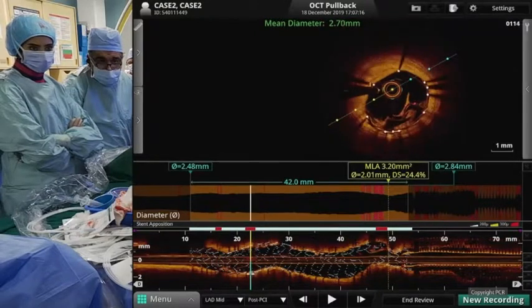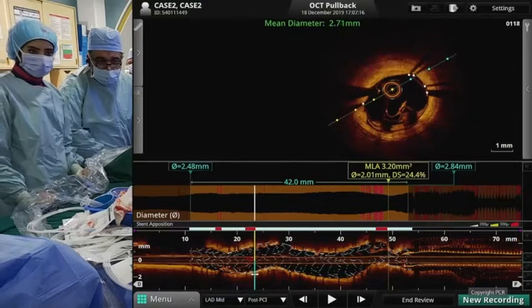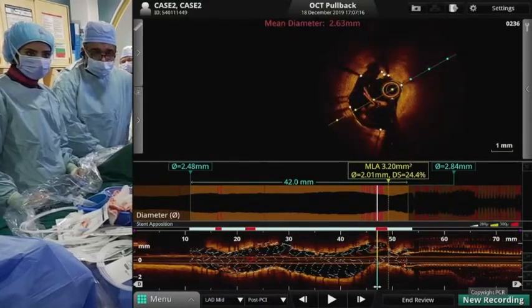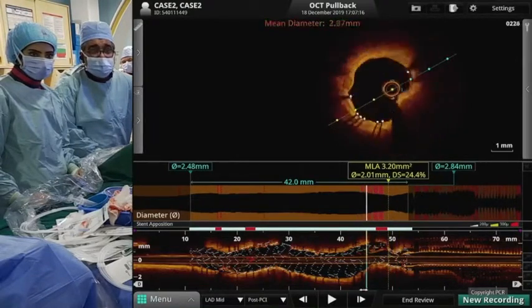So that's all artifact there. It's okay? Yes, artifact. Okay, so then you basically double check on the red areas. And let's go on the more proximal one and also the artifact. So the stent is well opposed. Now we need to look at the distal edge.